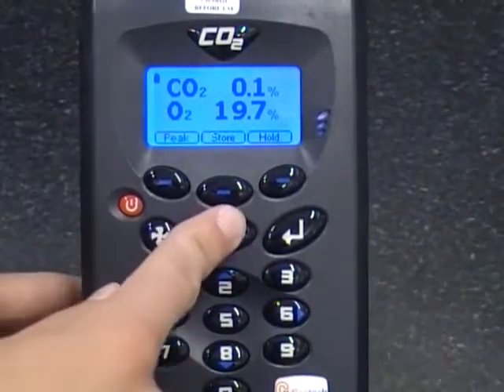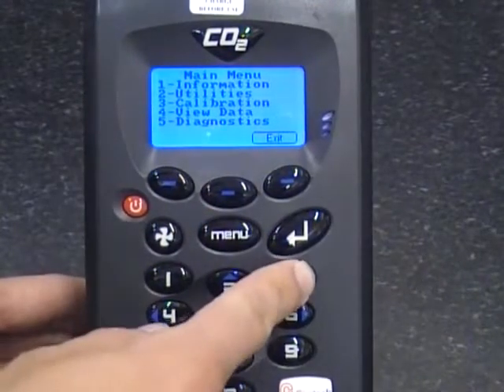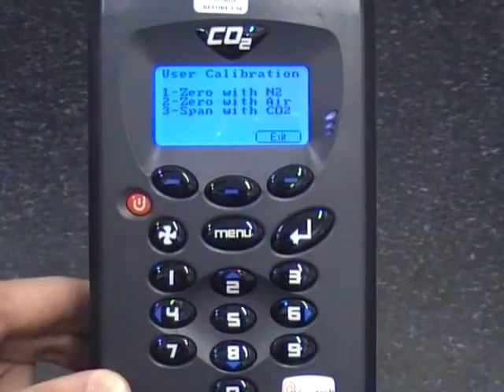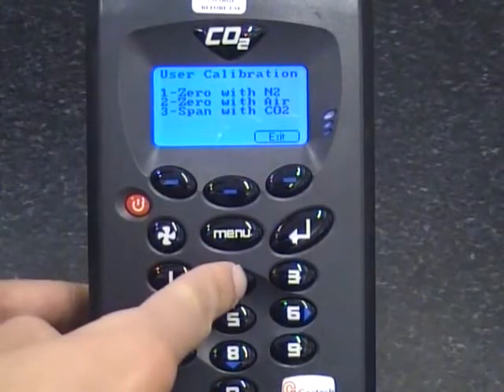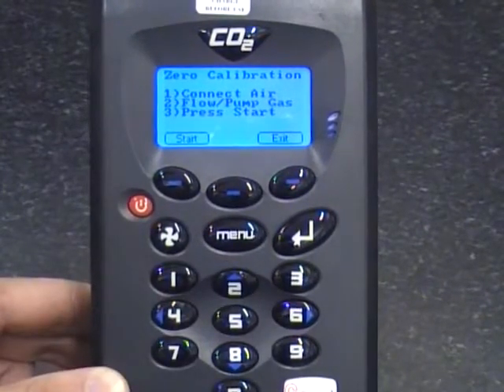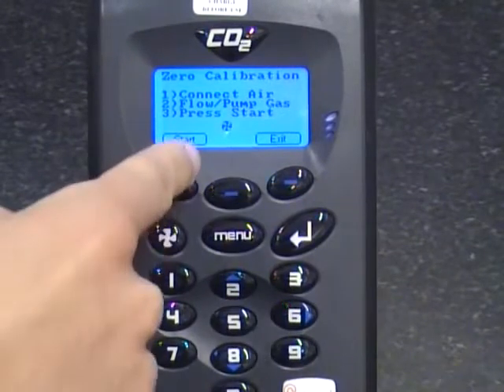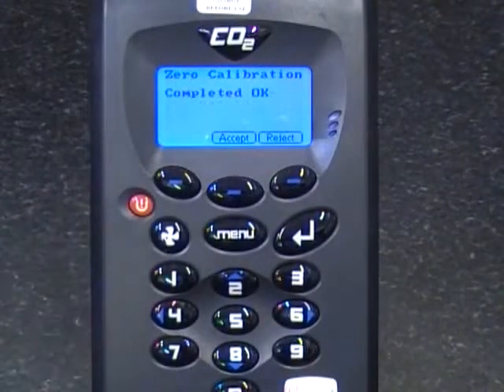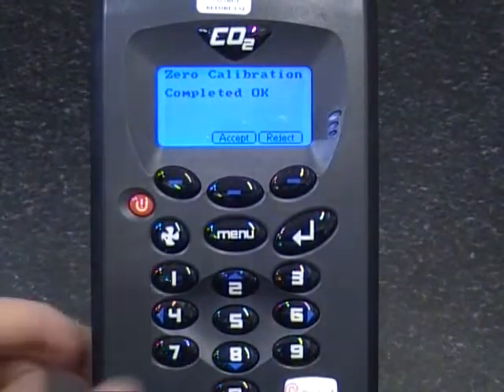Press the menu key. Press 3 for calibration and then press 2 for the CO2 channel. Key in 2, zero with air. Start running the pump and press start on the analyzer. Then wait until the analyzer indicates that the zero is successful and select accept.